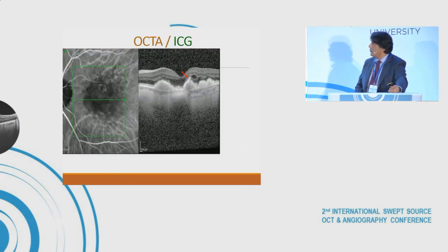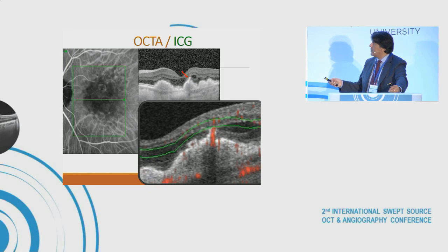And this small dot was really correlated with both the OCT and the flow we can observe here on the OCTA B scan. So the diagnosis is given even on this minimal lesion, and this is a name that appeared in the past months: the nascent type 2, type 3 lesion, nascent lesion.